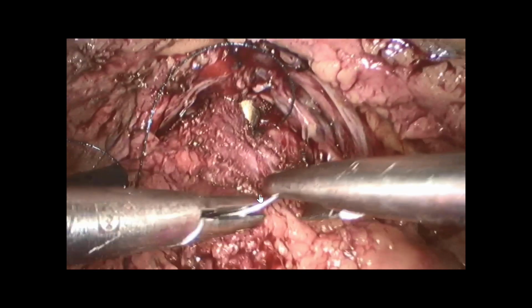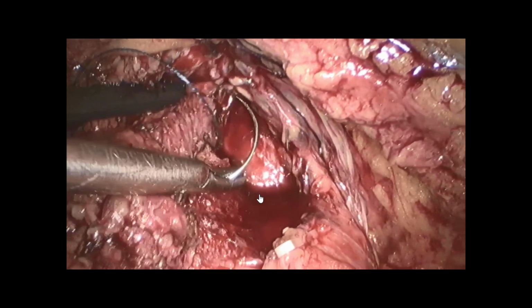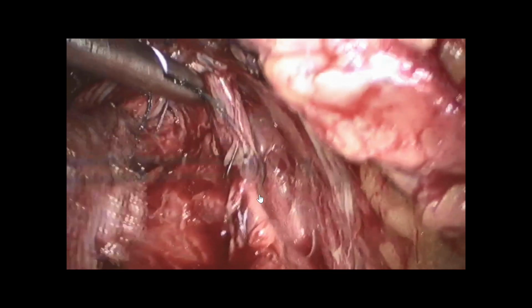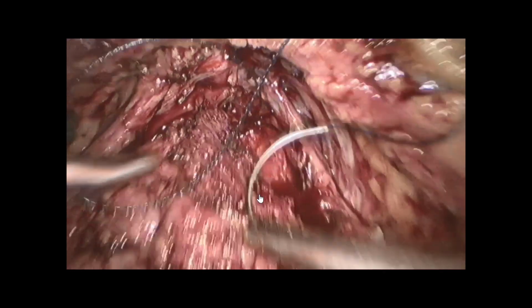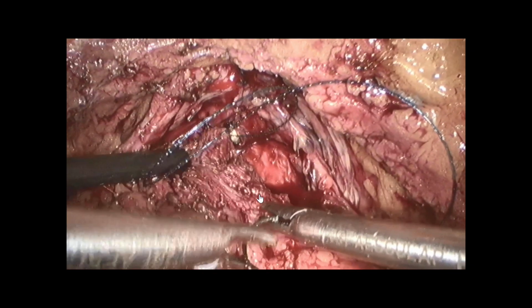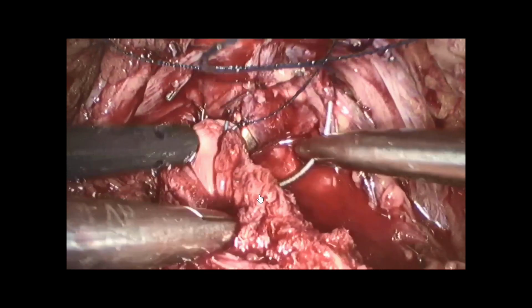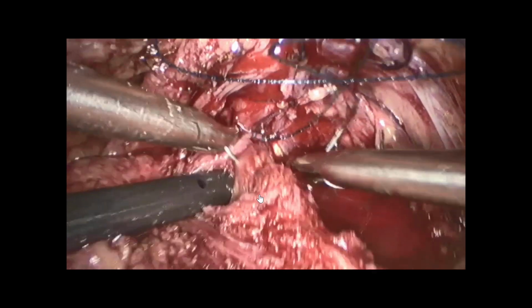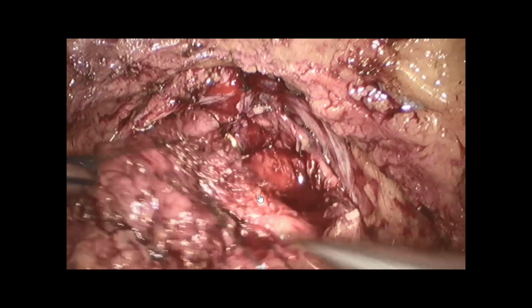That means that when you place the catheter, if the catheter is going behind the bladder, that means that you have to redo the anastomosis. Don't say, oh, it will be okay. No, you will have a small fistula, and then you will have bad results. So you see here, very important, this posterior plane here. And that's why now I add most of the time a Rocco stitch to pack a little bit more the posterior part of the bladder. I will do it always when I have tension, but most of the time if possible. So you see here, it's quite finished.